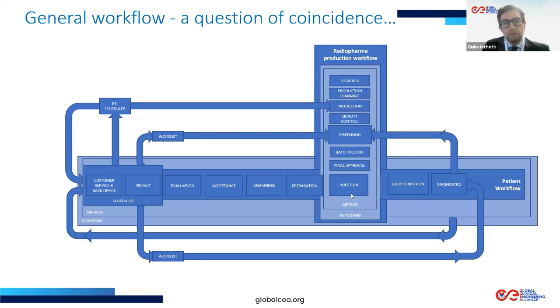When a patient has to do this kind of diagnostics, there is always a prescription of a tracer and an activity, a dose. And when the nuclear medicine physician gives you those, you always have to fix a calibration time. Okay, you always have to consider a calibration time.